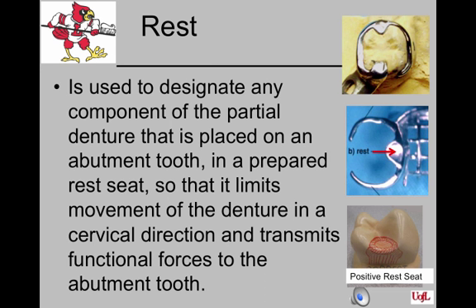The rest is used to designate any component part of the partial denture that is placed on an abutment tooth in a prepared positive rest seat so that it limits the movement of the denture in the cervical direction and transmits the functional forces to the abutment teeth.